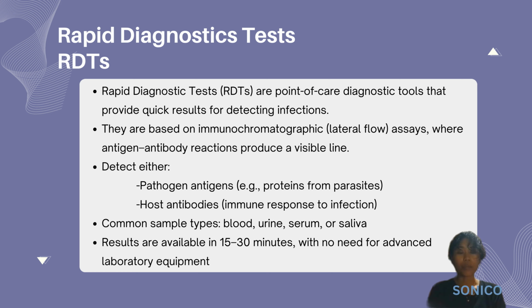Now, what are RDTs? RDTs are point-of-care diagnostic tools designed to quickly detect infections without the need for complex laboratory equipment. They are commonly based on immunochromatographic or lateral flow principles, where an antigen-antibody complex reaction produces a visible colored line on a test strip.